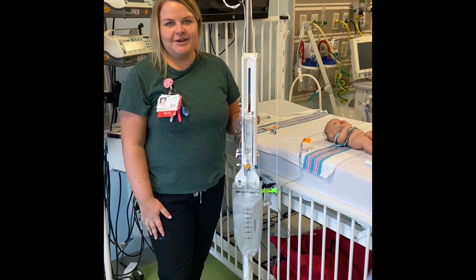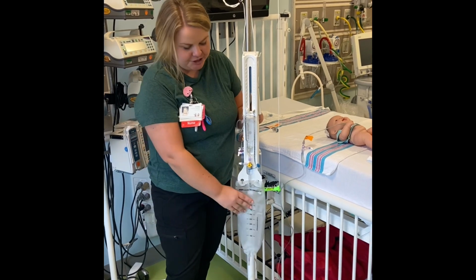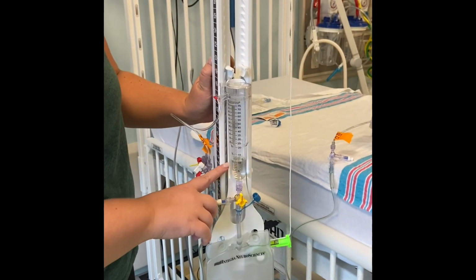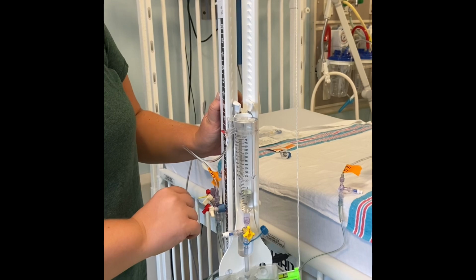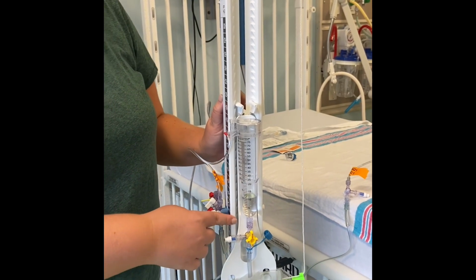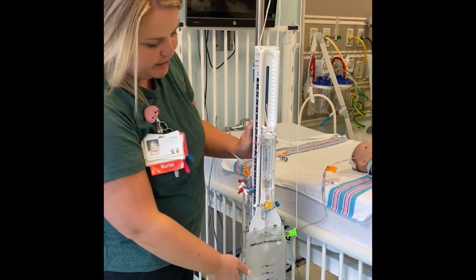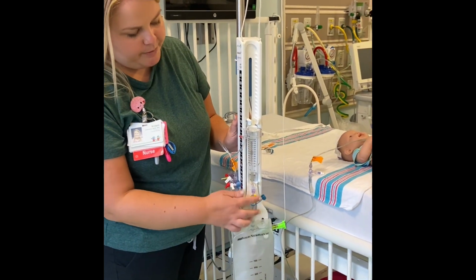This video is going to go over draining fluid from your buretrol as well as changing your EVD bag. So you'll notice here that there is currently 11 cc's in our buretrol that has drained from this patient's EVD. More than likely, you're going to have an order to measure your drainage every either 1 hour or every 2 hours. When you come in and you see this, you want to then empty this fluid into the EVD bag so that you can start over for your next 2-hour period.